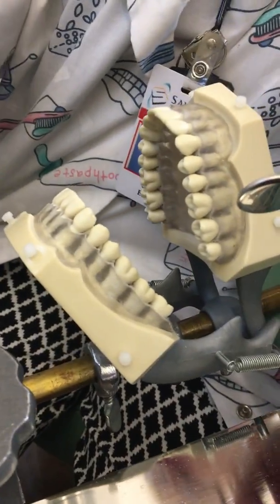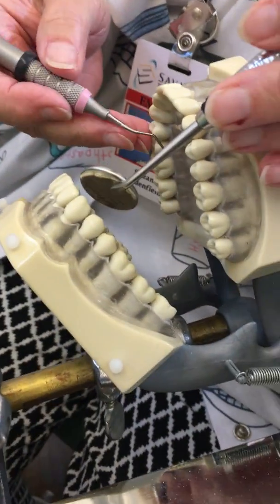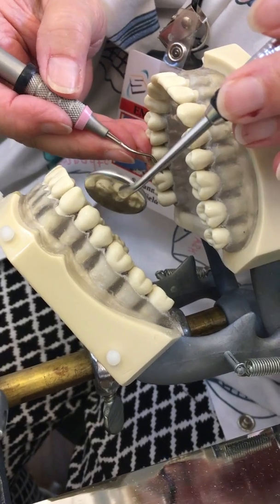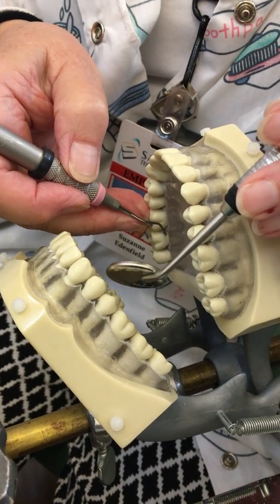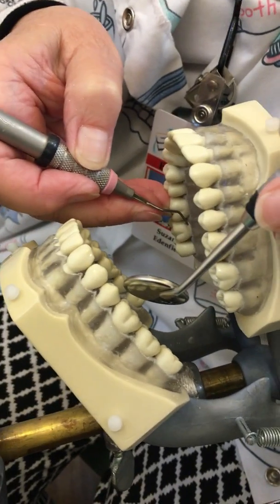Now we're going to move to the mesial Gracey, which is the 15/16. We're going to check it on the mesial in area three and check the lower third of the shank being parallel to the long axis of the tooth.